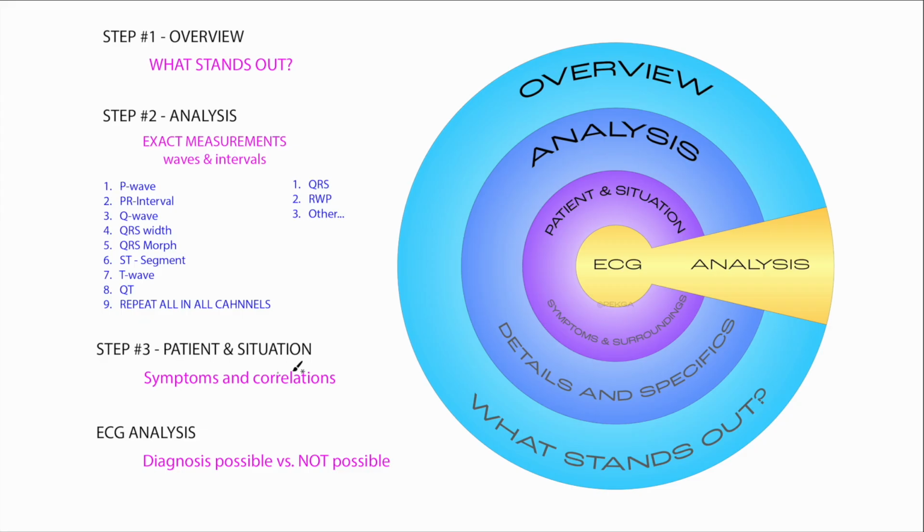And finally, you cannot exclude the patient circumstance and situation. So if the patient was complaining of symptoms or what was the patient doing at the time, those are all questions you're going to be looking at or trying to answer if you can. And the whole point there is to corroborate what was going on with the patient with what you're seeing on the ECG.